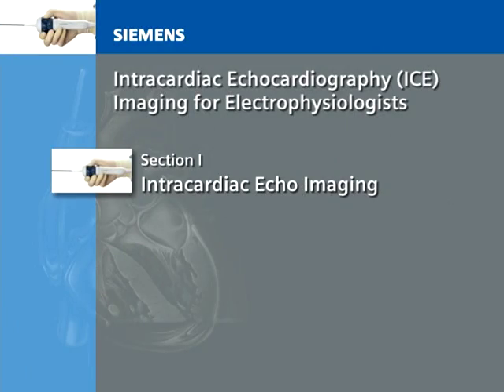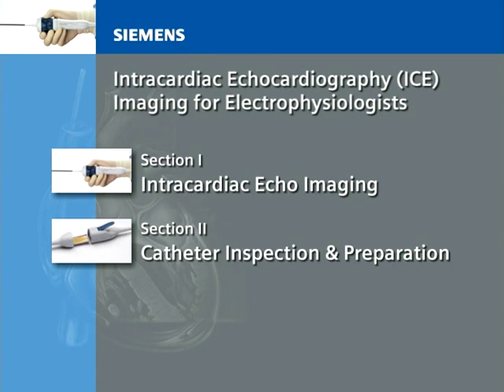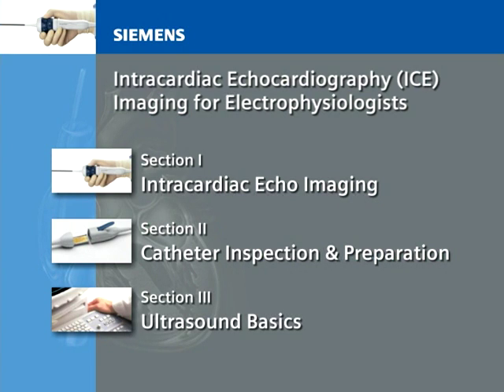This concludes the intracardiac echocardiography imaging section. Additional sections that can be viewed are catheter inspection and preparation and ultrasound basics.